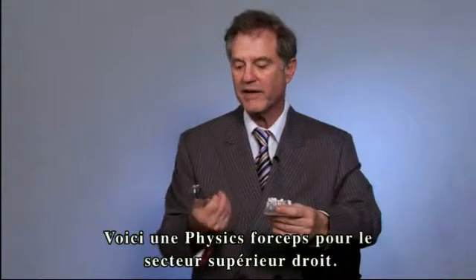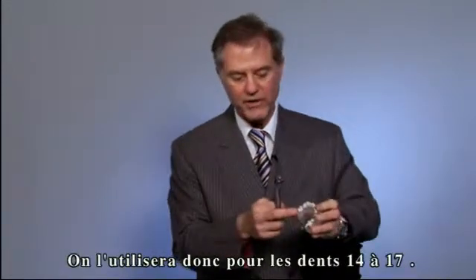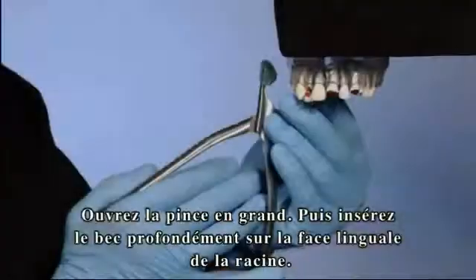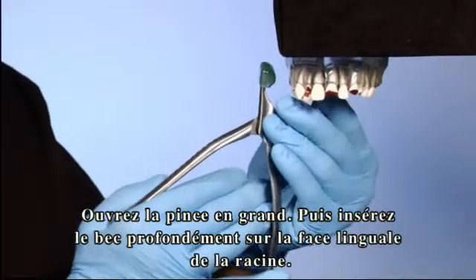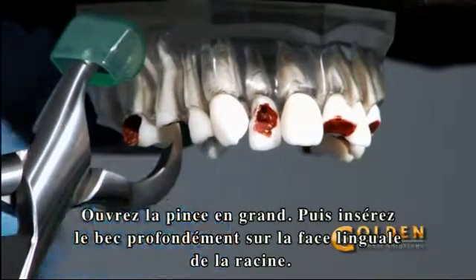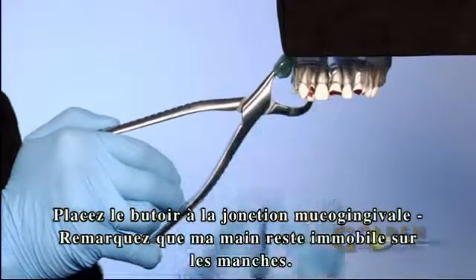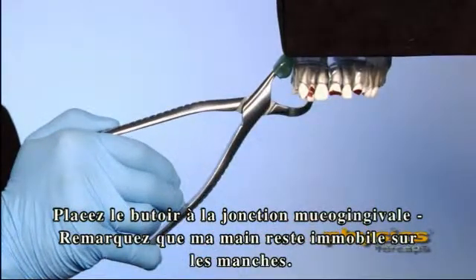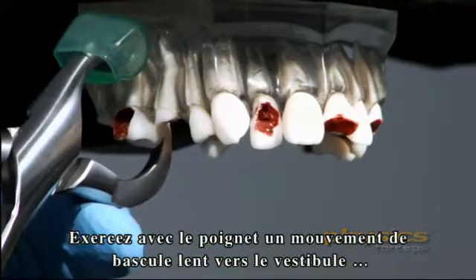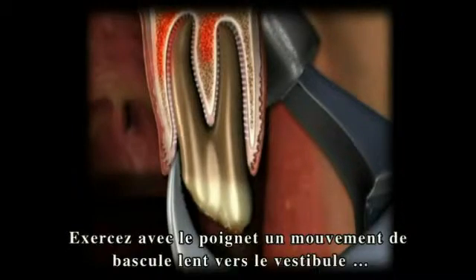I'm going to take an upper right physics forcep. This is basically used on teeth two, three, four, and five. First, open the instrument wide. Then engage the beak deep on the lingual aspect of the root. Next, set the bumper at the mucogingival junction. Note the fixed position of the hand on the instrument. Do not squeeze the handles. Slowly apply pressure rolling in an arc towards the buccal to accomplish an occlusal lift.